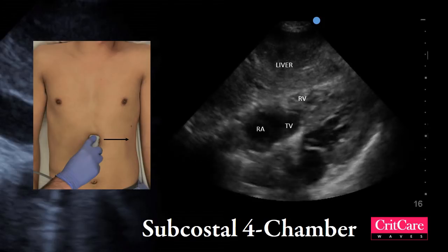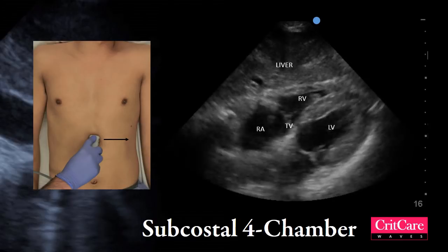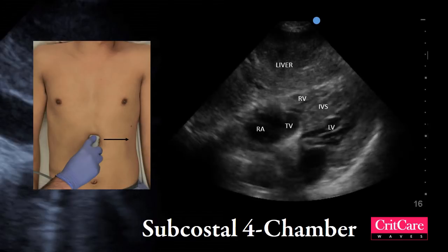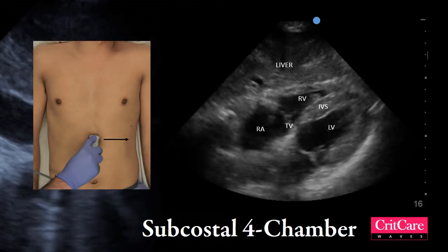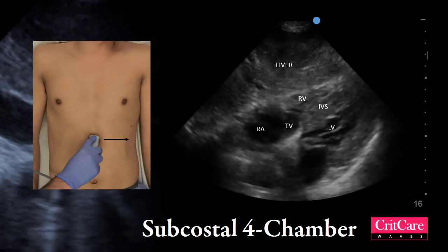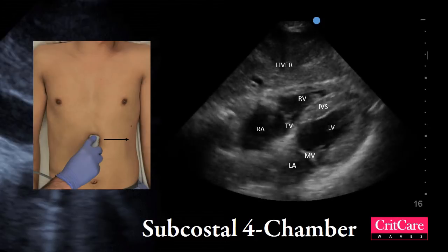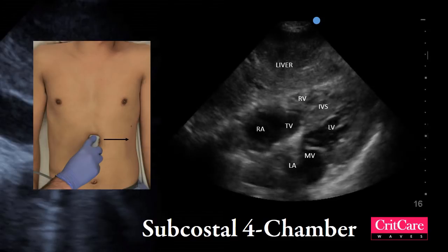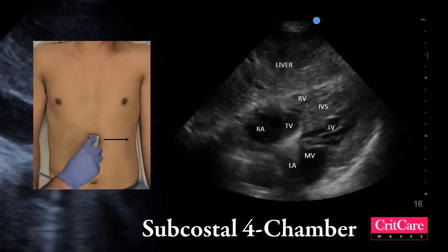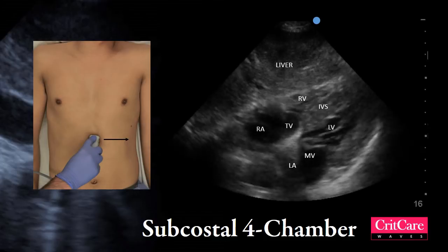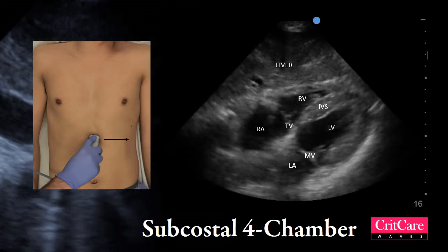The left ventricle is adjacent to the right ventricle with the interventricular septum in between. The left atrium is next to the right atrium. The mitral valve can be seen between the left atrium and ventricle. This is a good view to perform during a cardiac arrest, as it is not in the way of chest compressions.